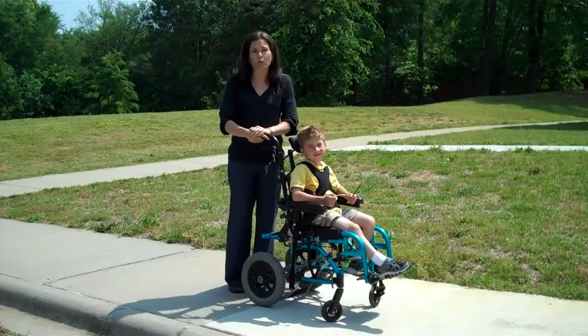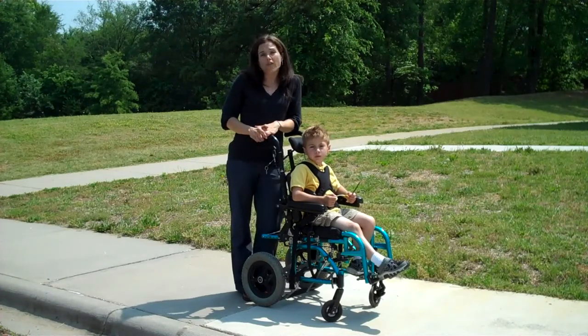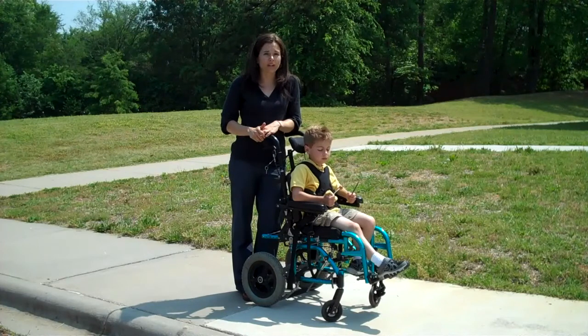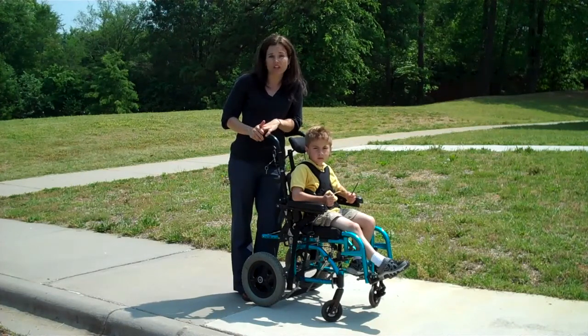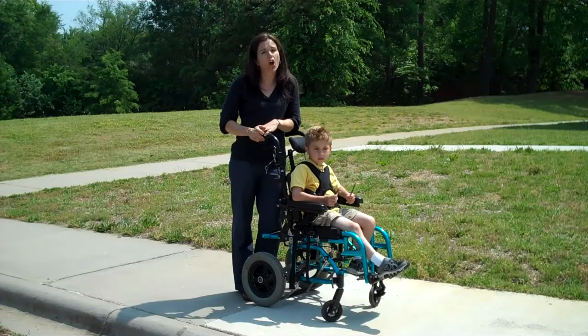It is very easy for one of the chair wheels to tip over and fall, and this would have disastrous consequences for the child. I'm often asked if it's okay for a student or a peer to push the child in a wheelchair. If that student has good safety awareness and has been picked by the teacher and the school-assigned physical therapist, that peer can be trained on the proper procedures for pushing a child in a wheelchair in the school. It is not okay to have any child push a child in a wheelchair outside. This should always be done by an adult.